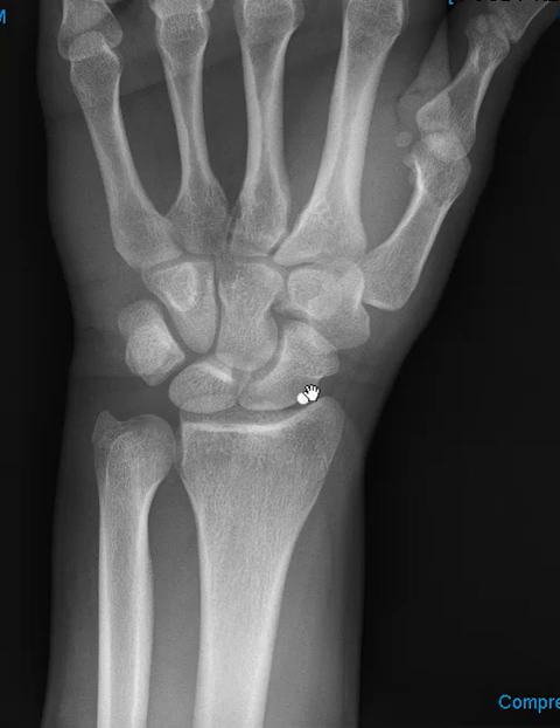That's why we do the procedure prior to MRI — it helps us evaluate ligament tears and TFCC tears. And we're going to start off with this view.